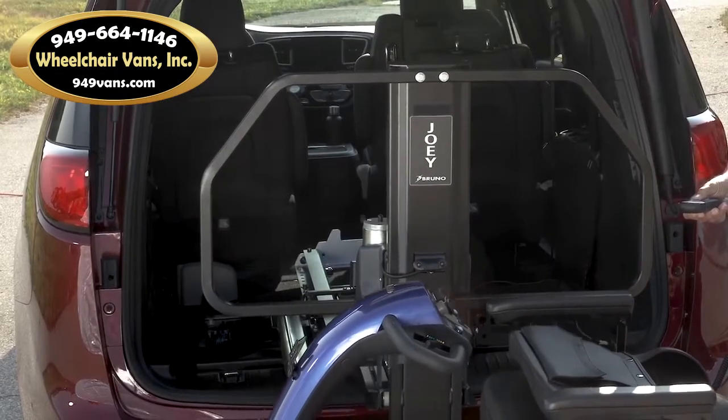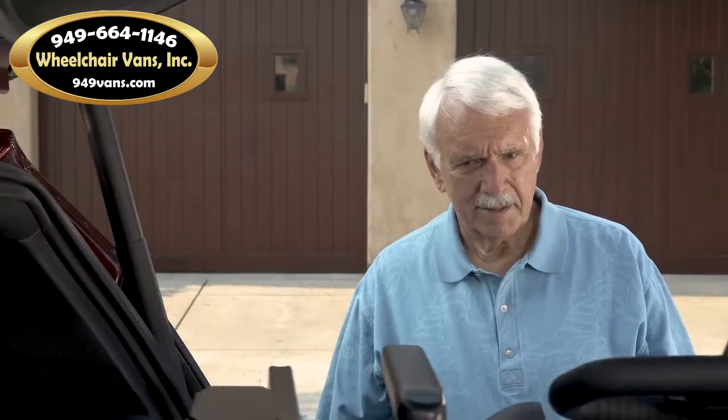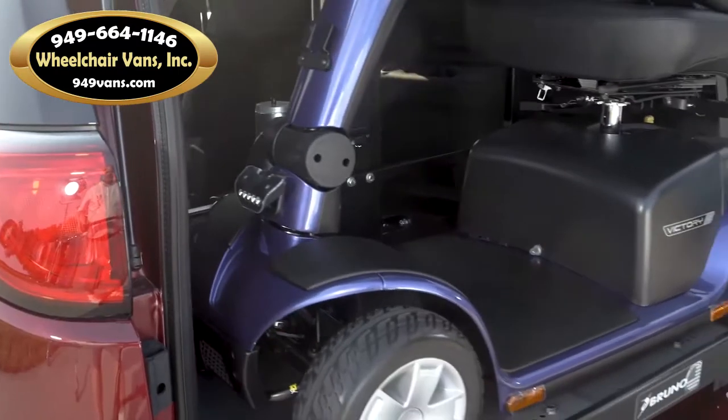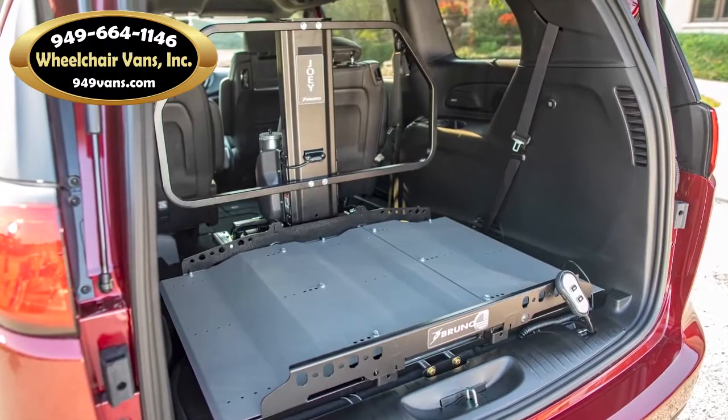The Joey's exclusive safety barrier ensures the mobility device stays secure and unable to enter the passenger area even during sudden stops. The safety barrier eliminates the need for securement belts in most vehicles.